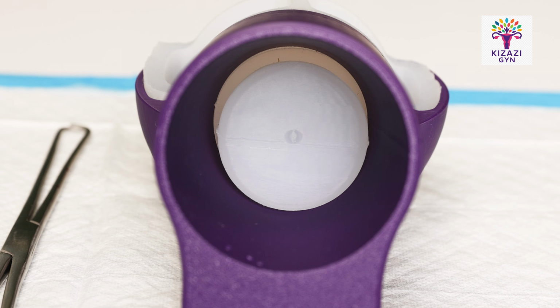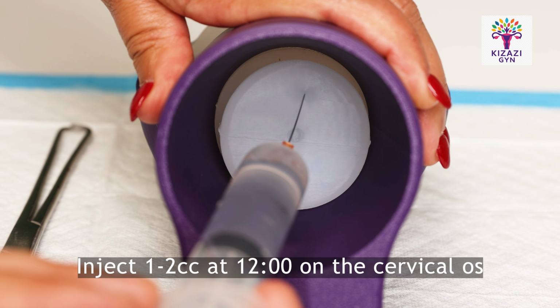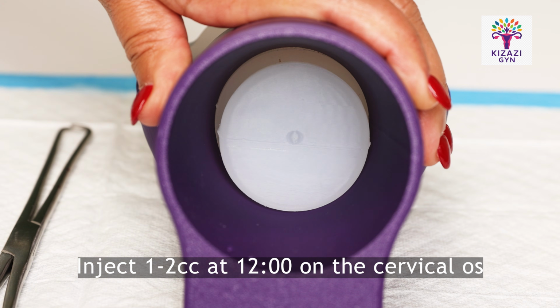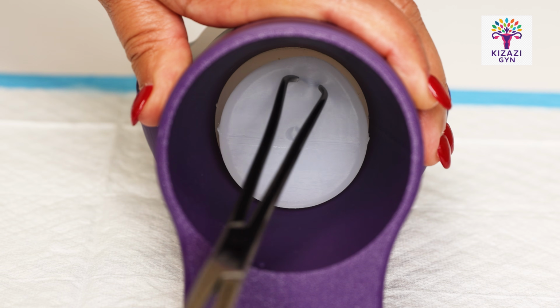Let's practice doing the tenaculum placement on the more advanced model. So again, we're practicing hubbing the bevel of the needle, pretending to inject 1 to 2 cc's to create a wheel. Then we're going to go ahead and place the tenaculum.